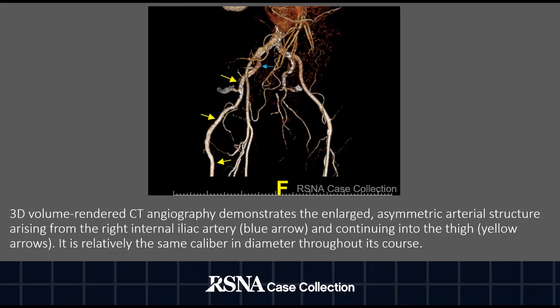3D volume rendered CT angiography demonstrates the enlarged asymmetric arterial structure arising from the right internal iliac artery, as demonstrated by the blue arrow. It continues into the thigh as demonstrated by the yellow arrows, and is relatively the same caliber and diameter throughout its course.